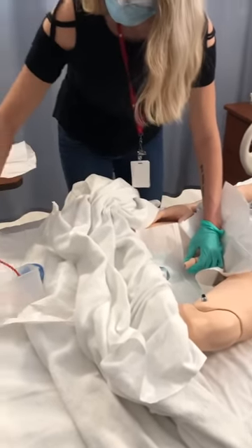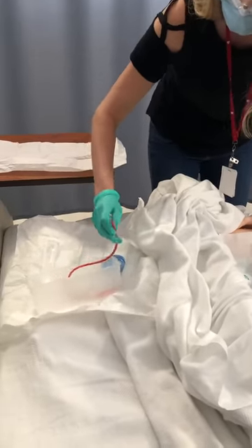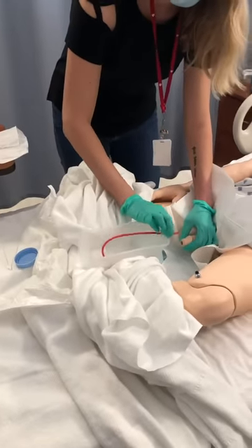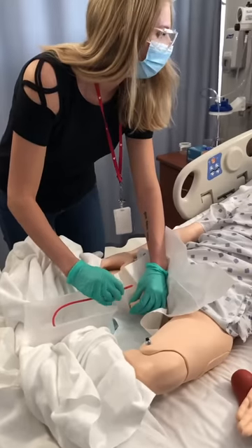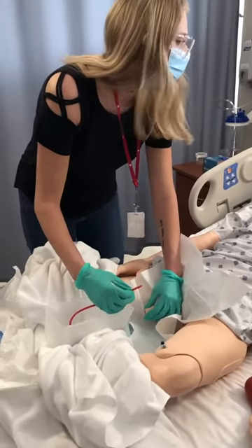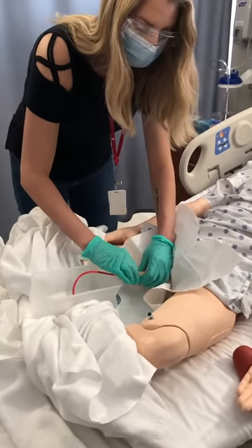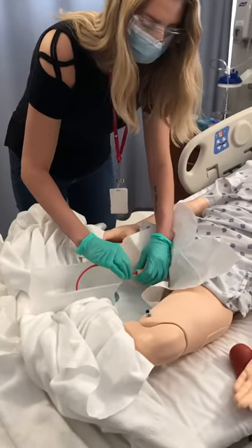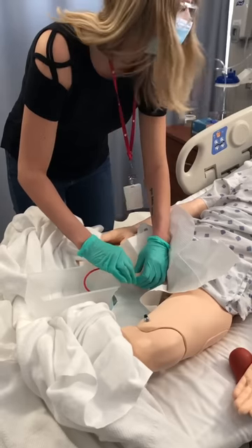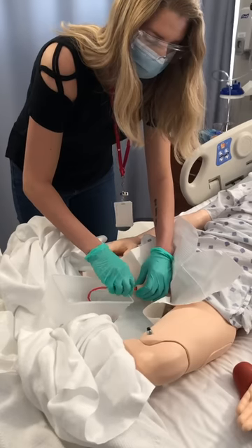Now I'm going to lubricate the tip of my catheter. Could you just bear down for me, please? You're going to go as if you are urinating. Are you able to do that? I can do that. So we're just going to slowly insert this. Just try to relax as much as you can — I know it's not easy. It's all right. I think it's going all right, don't you? I think so. That's good.